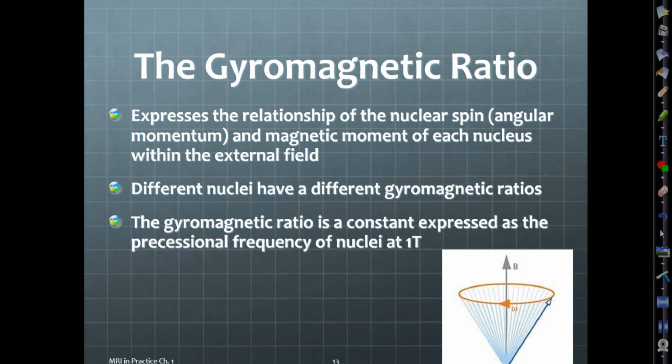And that makes sense because you have typically more protons inside the nucleus than neutrons, and that gives it net spin. And anything that has net spin creates a small little magnetic field around it. So we can image those things in MRI, but why do we typically not image carbon and oxygen? What's the issue with it? They're not as abundantly found in the body. They're not as abundant and found in the body as hydrogen. Good.